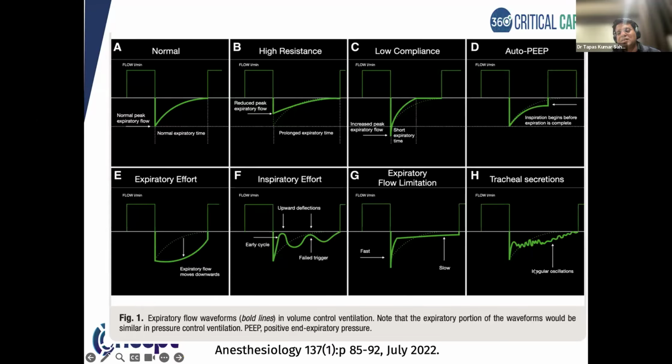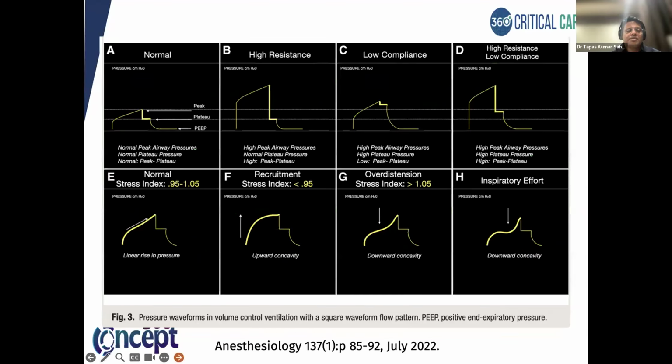If you are getting tracheal secretions, you would get all these irregular oscillations. Okay, this is an excellent article. I would share the picture with you also.